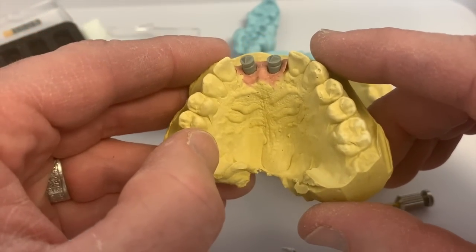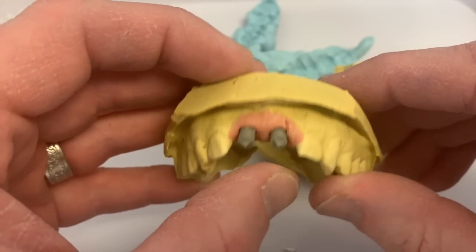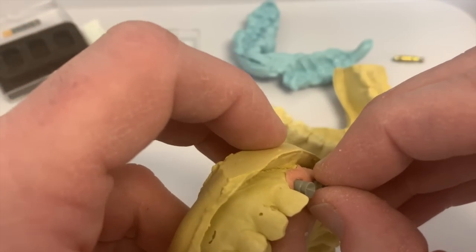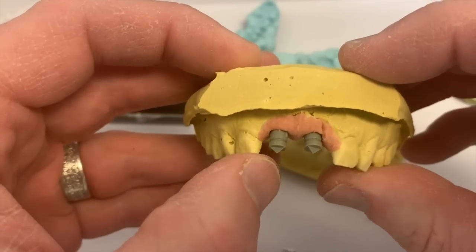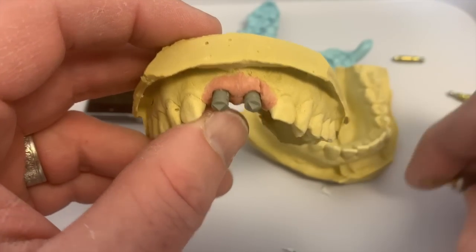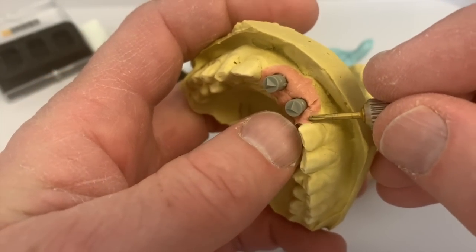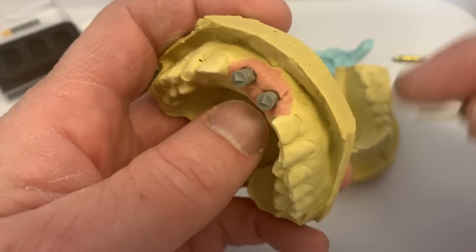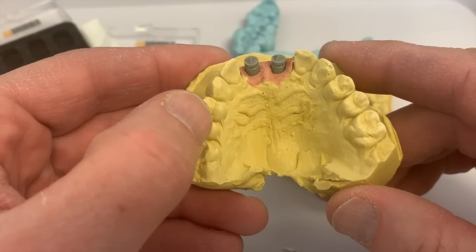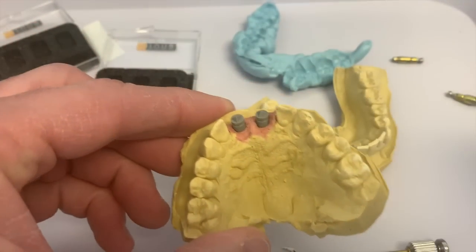Now, bear in mind that when we're designing anterior crowns in particular, we want to intentionally create a very nice emergence profile at the expense of the tissue that's currently in place within reason, because we want to mold intentionally the tissue. Now, sometimes that tissue molding requires some tissue training with a temporary PMMA or acrylic or some sort of an abutment. But I would rather create an ideal emergence profile that yields a long-term healthy gingival outcome than create an anemic one.